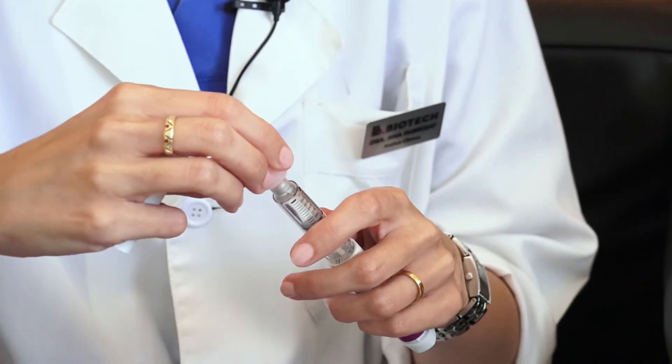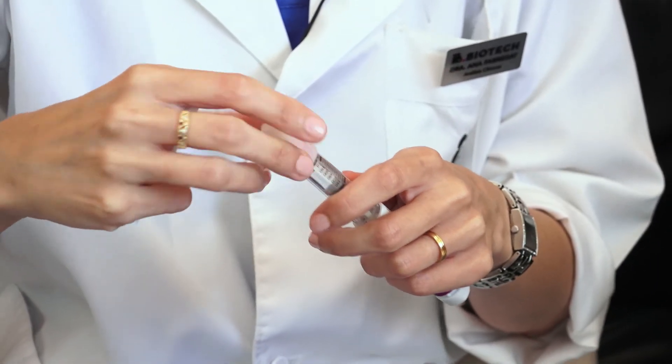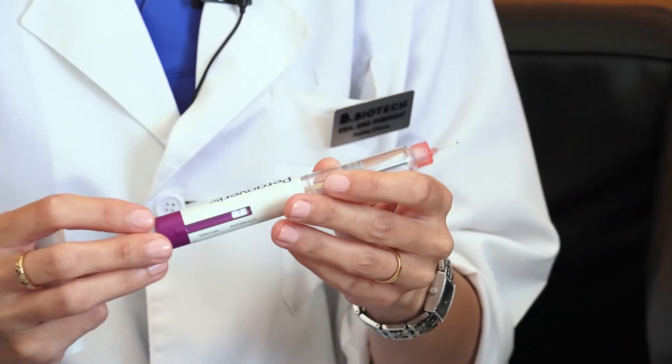Put the subcutaneous needle into place by screwing it into the device. Remove the safety protection cap and select the recommended dose at the top of the device.